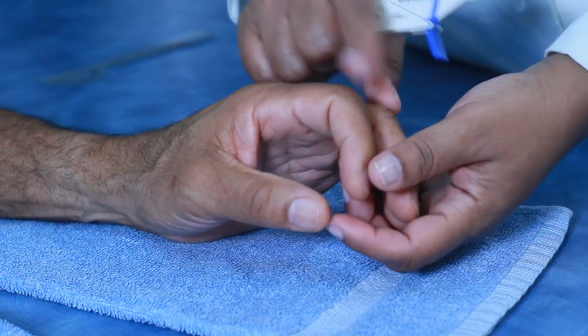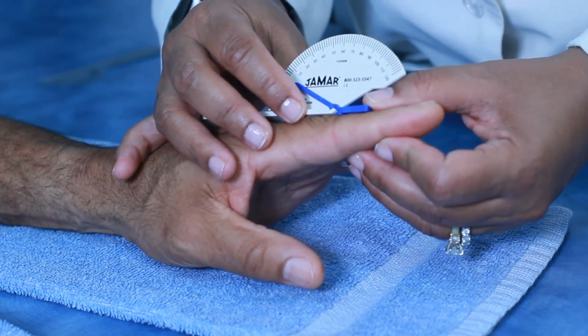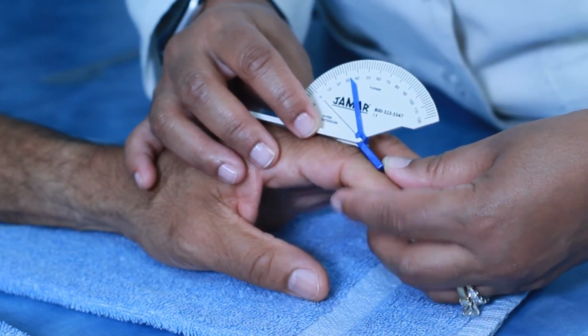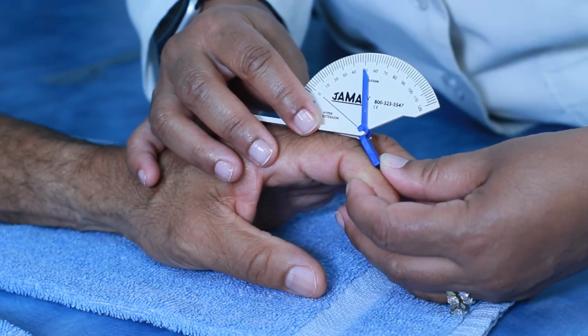So now we're going to move to the PIP joints. As stated, he can get to 0. So there's your 0, and then here he's getting to 50. Remember the fulcrum is right over the dorsum of the PIP joint, and there's your measurement there.